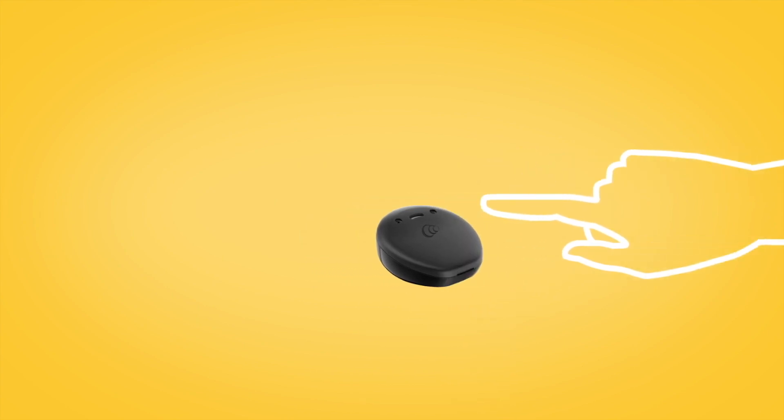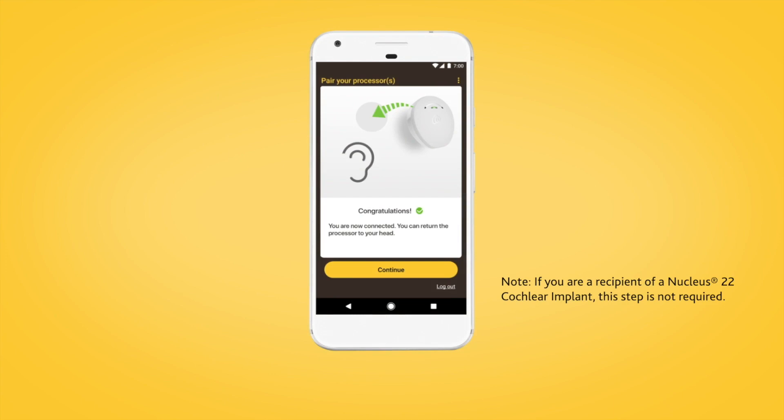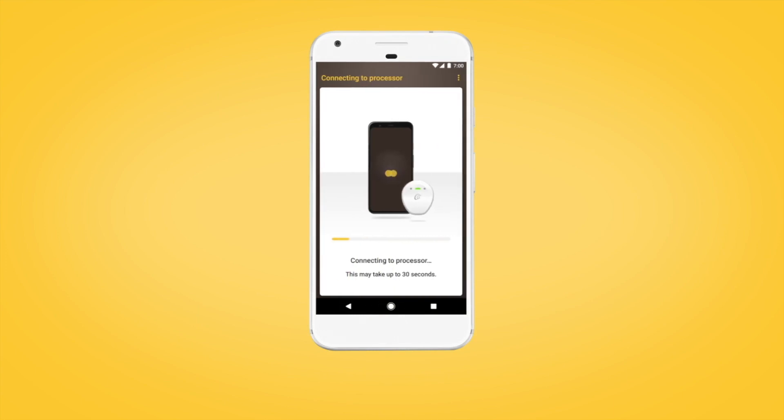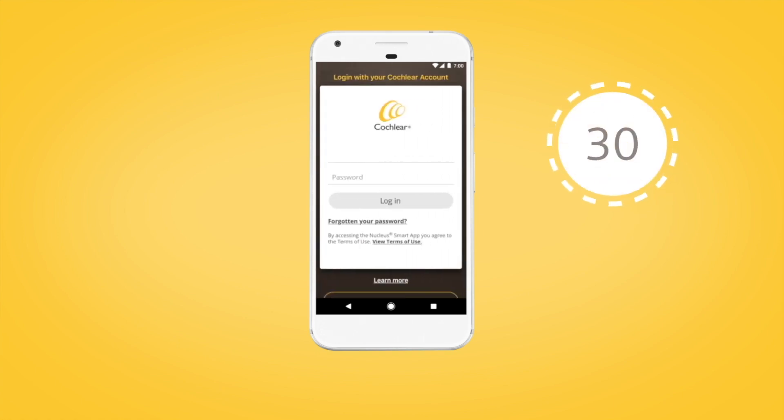Then return your sound processor to your head when prompted. Tap Continue to complete pairing your sound processor. This may take up to 30 seconds. If prompted, enter your user details.